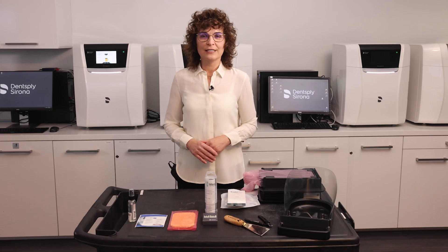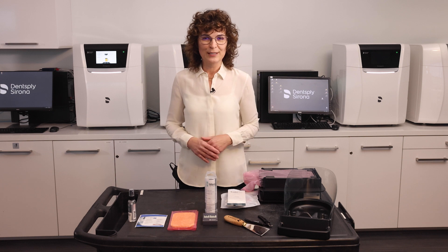With your Prime Print solution you receive a box with accessories. I would like to describe them and their use, and please keep them accessible at all times.